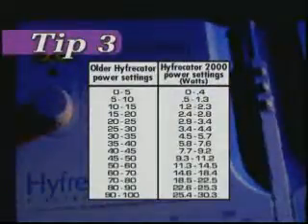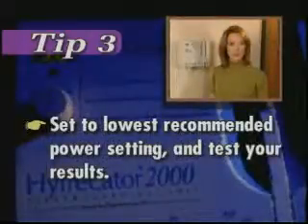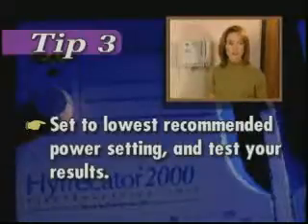Tip 3. If you own an older Hyfrecator and are not sure of the power setting at which to set your new Hyfrecator 2000, consult your power chart. Set the instrument to the lowest recommended power setting and test your results. If you need more power, slightly increase the level and test your results again. Remember to start low and make small incremental increases until you get the effect you want.